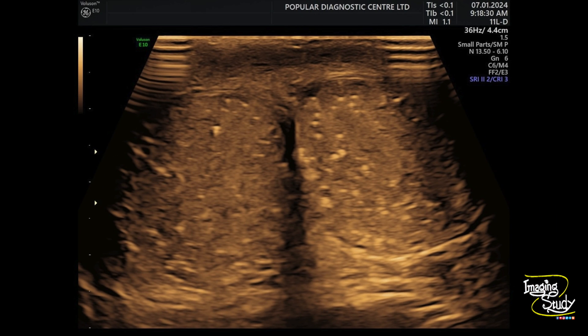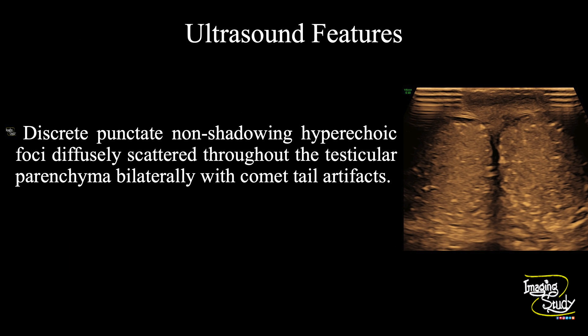Here is the transverse section where you can compare the echogenicity, size, and amount of microlithiasis. In summary, discrete punctate non-shadowing hyperechogenic foci diffusely scattered throughout the testicular parenchyma are seen bilaterally with comet tail artifacts, indicating a case of diffuse testicular microlithiasis.